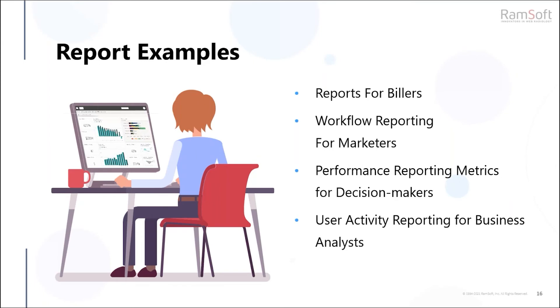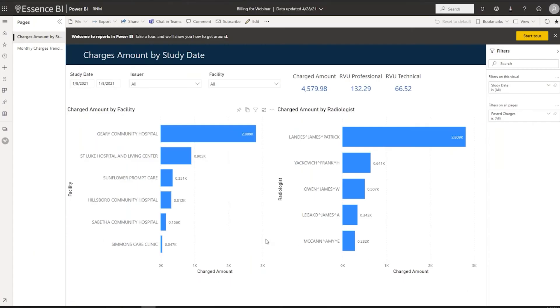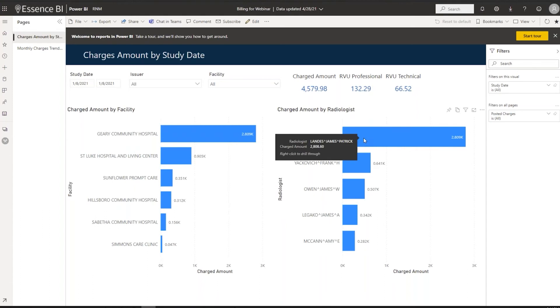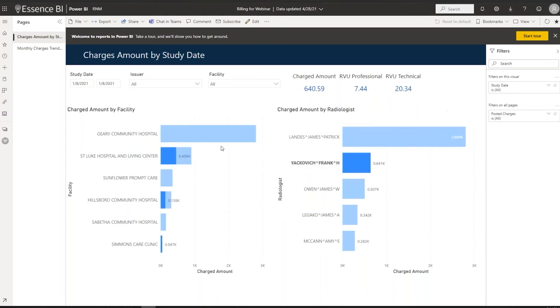Now for the moment you've all been waiting for — some examples of what the actual software looks like. We're going to open it up and take a look at some reports from our demo server and from an actual customer, so you can see what RamSoft data actually looks like in this new platform. Here is Essence BI in our demo server. You can see some billing data on this report — charged amounts, RVUs, professional RVUs, an overview of all the different centers, and radiologists. The visualizations are actually interactive, so if I click on one, the other visualizations change.